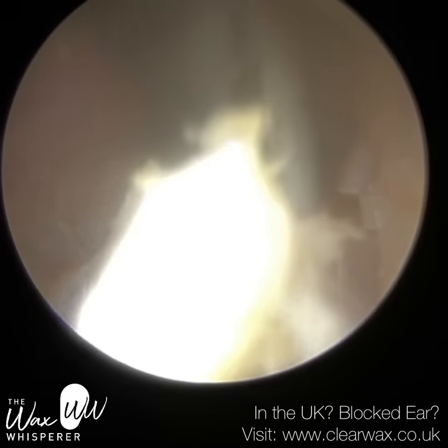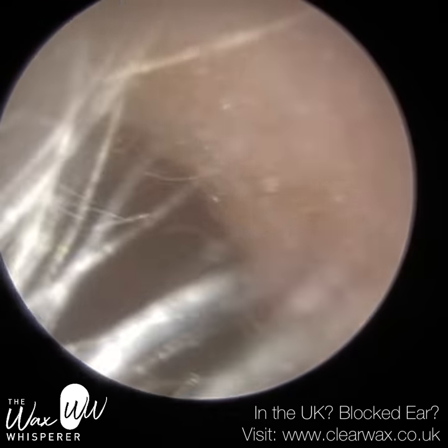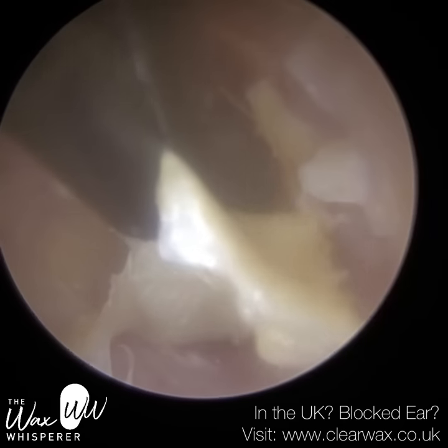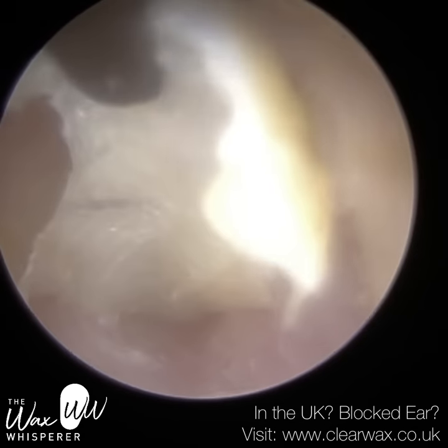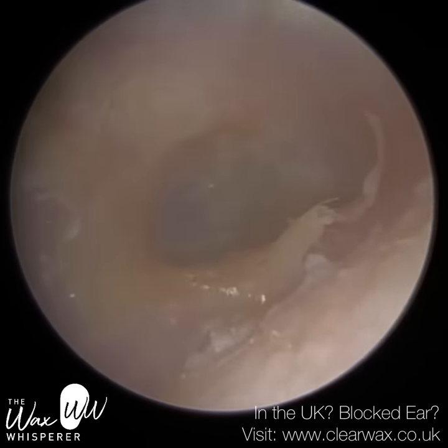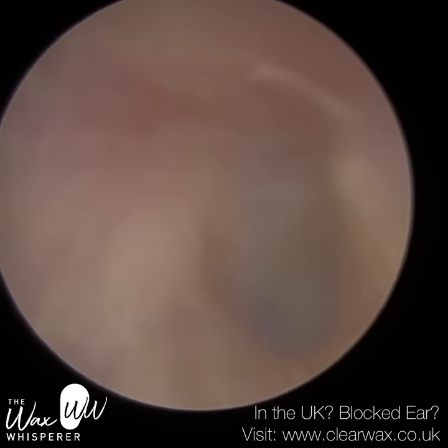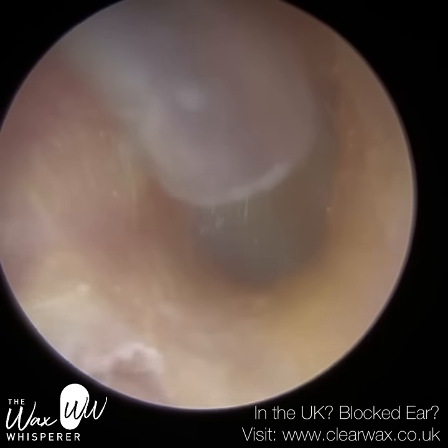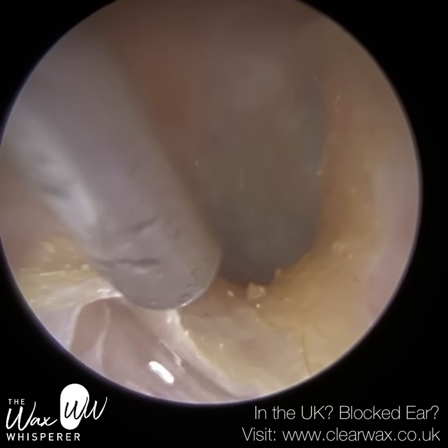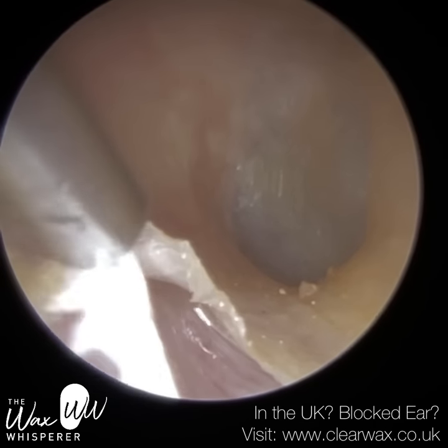Once again I'm just going to use the forceps — just going to pinch it at the top and bring it out. The patient has got quite a bendy ear canal, which you'll see a bit later on. There's a bit of dead skin in the anterior recess. As we approach the eardrum, the ear canal narrows and then widens back out again. Where it widens, it creates a little recess at the front part of the ear canal adjacent to the eardrum — we call that the anterior recess. It also creates a little trench at the base of the ear canal near the eardrum — we call that the inferior recess. I've just put some oil in.